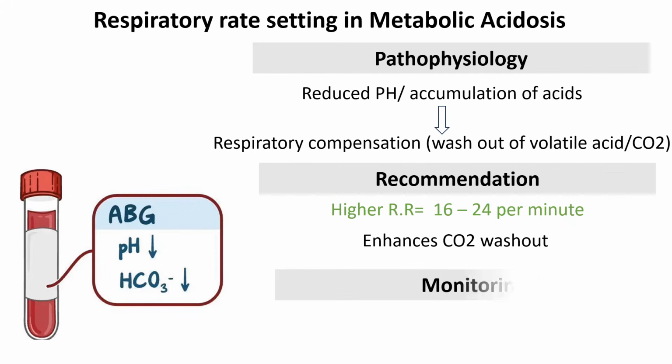It's important to closely monitor arterial blood gases to ensure that the ventilatory support is effectively managing the patient's acid-base status without causing respiratory alkalosis or other complications.